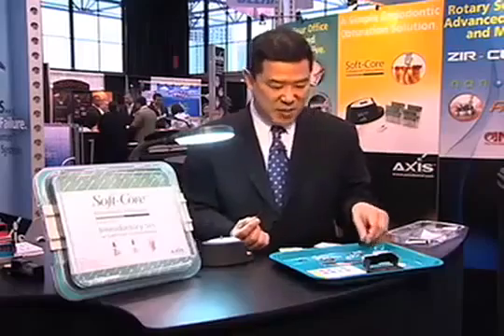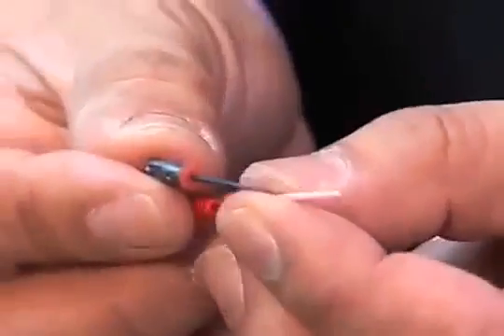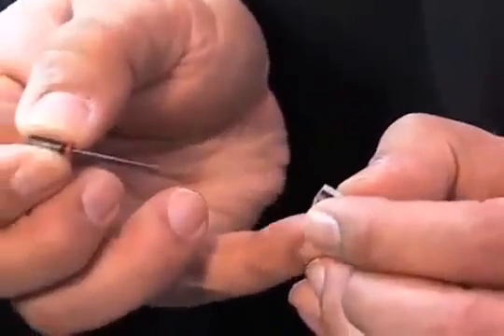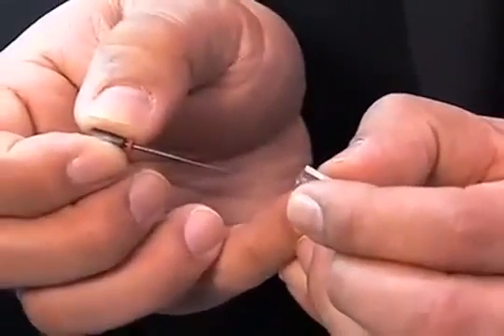One thing I like to say about these size verifiers is they're made of the same material as the core of the obturators. So you can be sure that, for example, this is a number 25, that the number 25 obturator at the tip is going to be the same. When I'm shaping the canal, typically as my final instrument, if this is a 25, I'll use a number 30 file to just make sure that this fits really nice and loose, so that you're not going to run into trouble trying to insert the obturator to the apex.